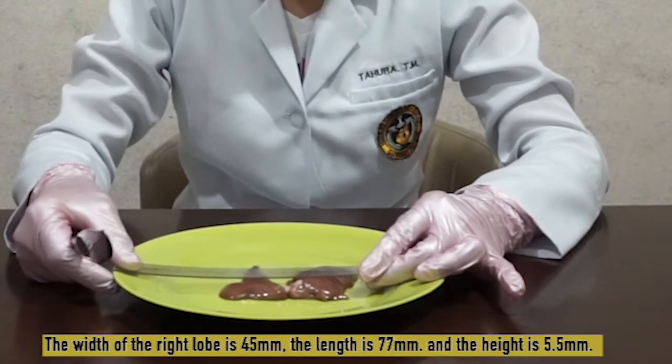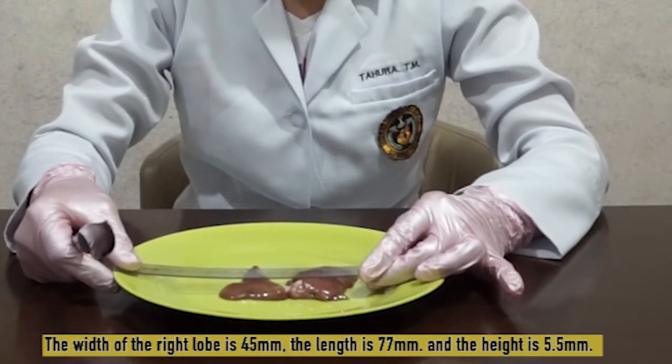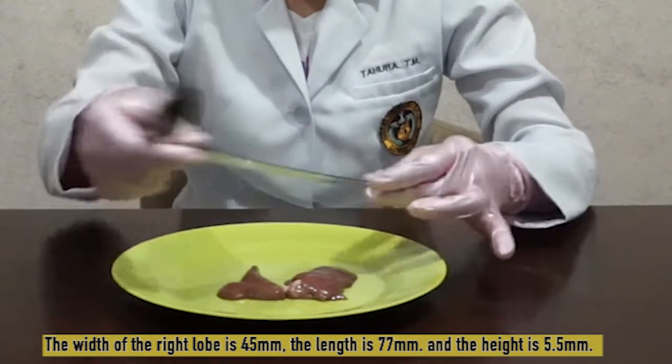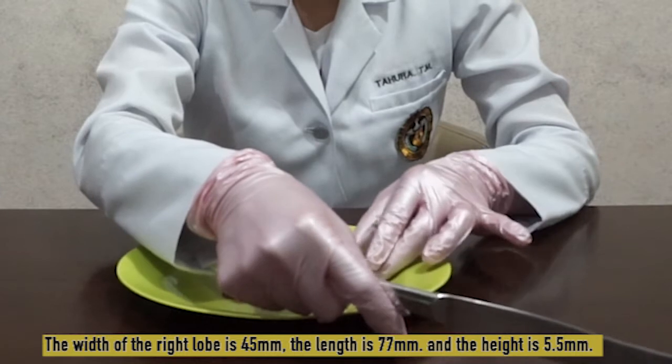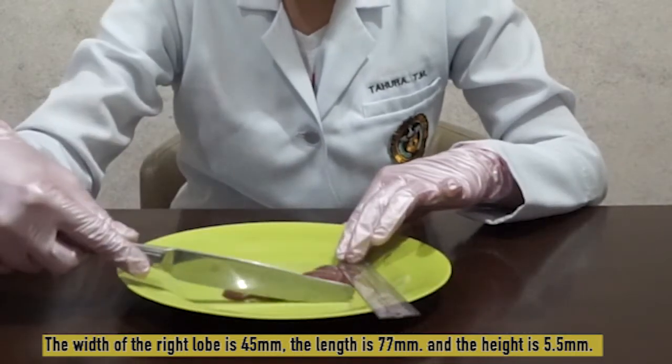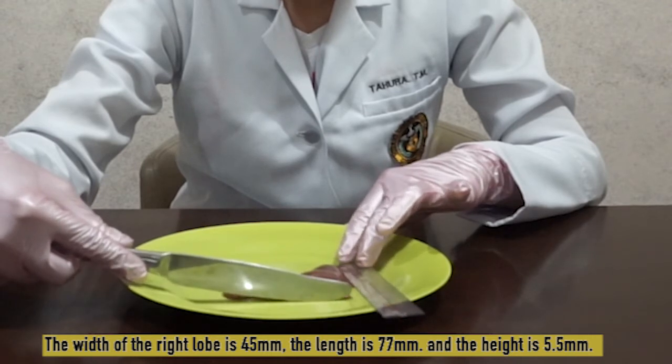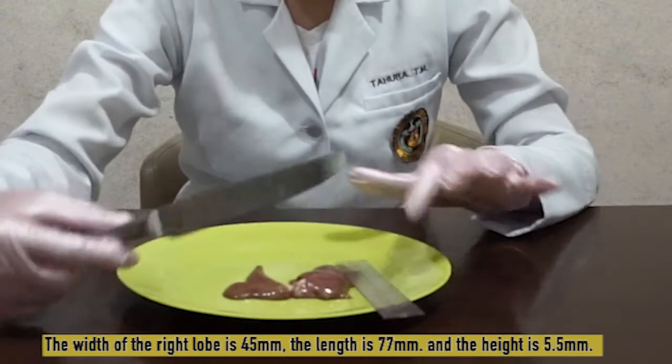The width of the right lobe is 45 millimeters. The length of the right lobe is 77 millimeters.